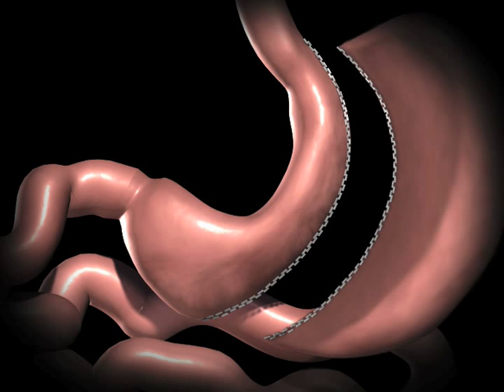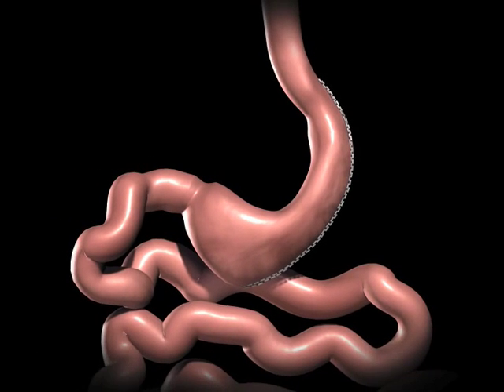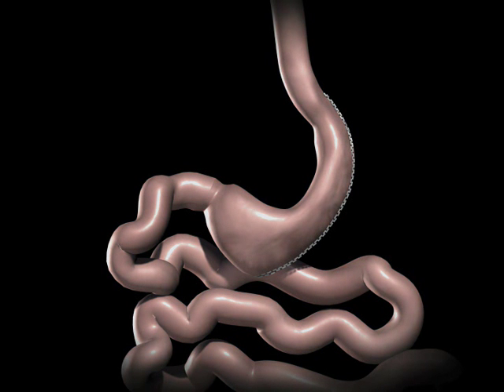The rest of the stomach is removed. The newly created gastric sleeve is able to hold approximately one-tenth of what the stomach was able to hold before.